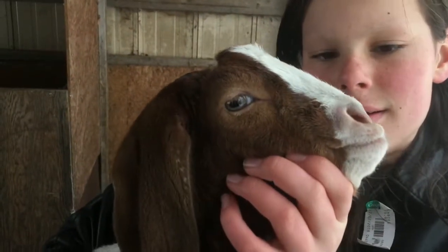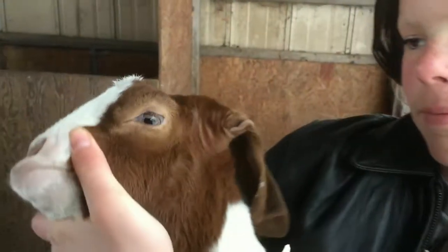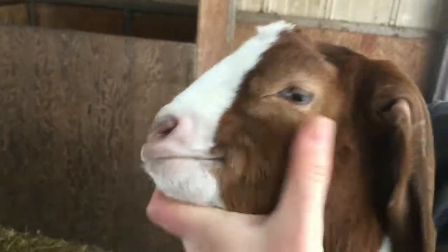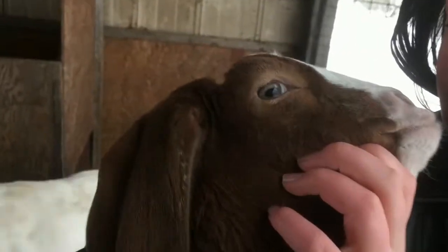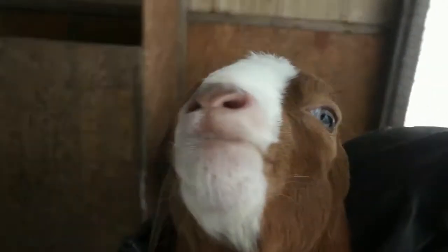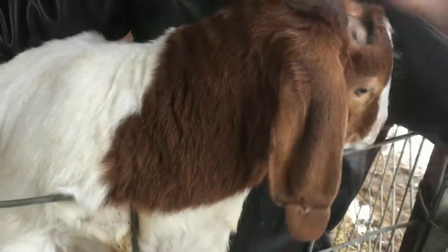Here's a little goat that was born on the 12th of January that we did the Entropion penicillin shots under the eyelid on. We did it right underneath here, and above, on both sides, and above even on one of them. And as you can see, it worked. He has absolutely no eyelash interference onto his eyeball. He's sitting really still right now. And it was a successful procedure.